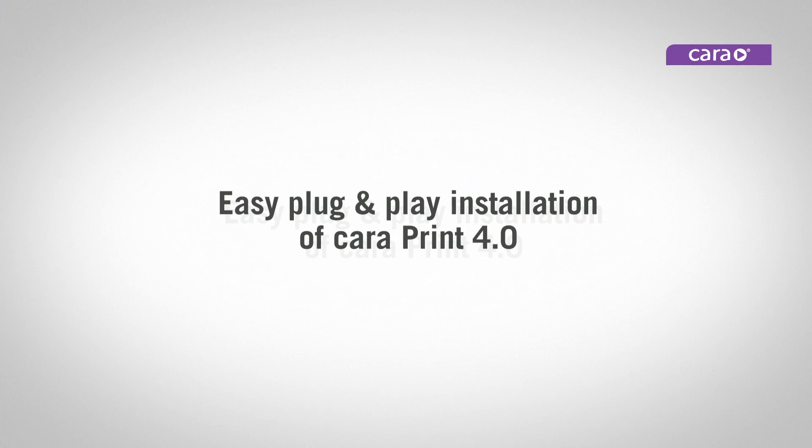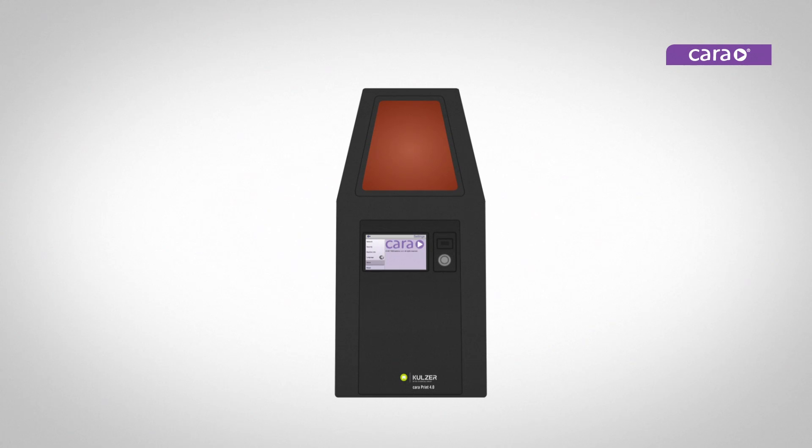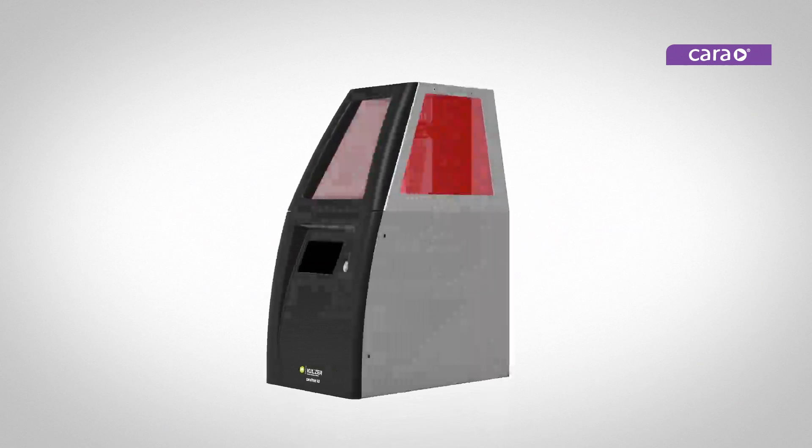Your much-anticipated CaraPrint 4.0 has finally arrived and you probably can't wait to get started with your first 3D printed restoration. Use this quick installation guide to help ensure your success from the very first print.